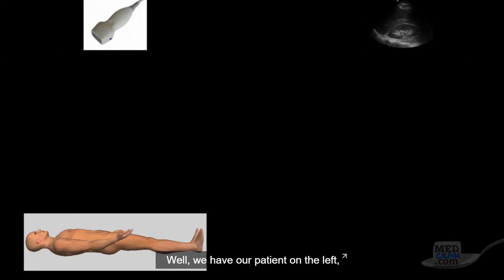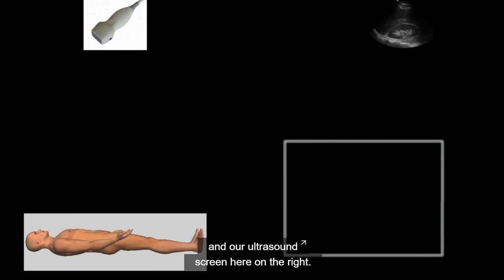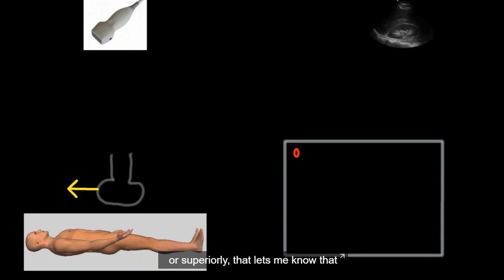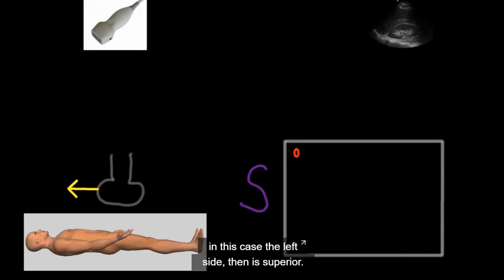So how does this work? Well, we have our patient on the left and our ultrasound screen here on the right. We're going to place the ultrasound screen indicator on the left side of the screen. So if I place my ultrasound transducer on the patient and I point the indicator towards the patient's head, or superiorly, that lets me know that where the indicator is on the screen, in this case the left side, then is superior.